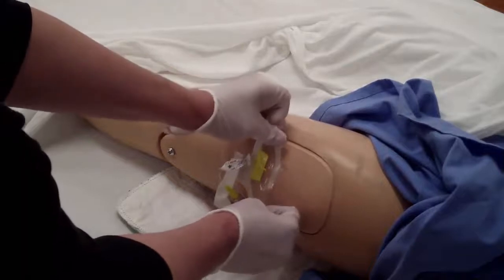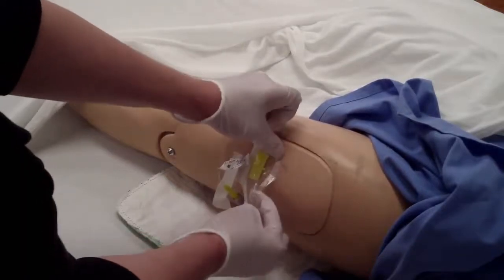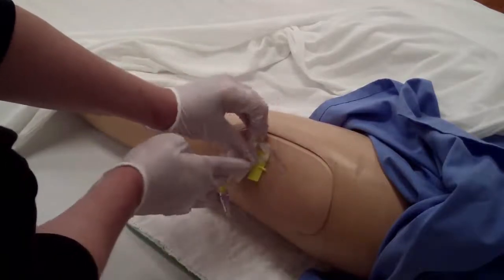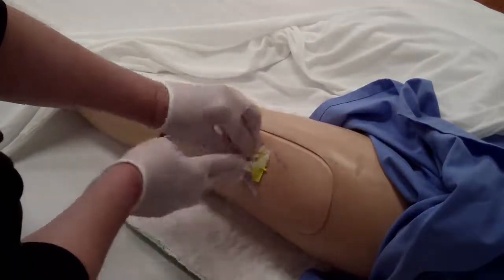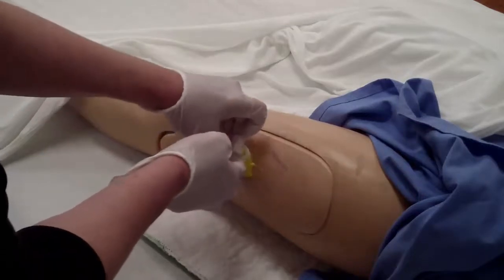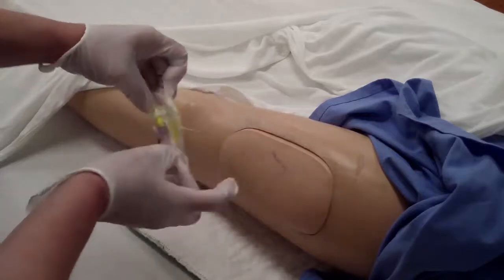Gently remove the dressing by stretching the Tegaderm. As you can see, gloves can be problematic, but try to remove the tip of the butterfly cleanly from the insertion site, and then check the tip to ensure that it's intact.